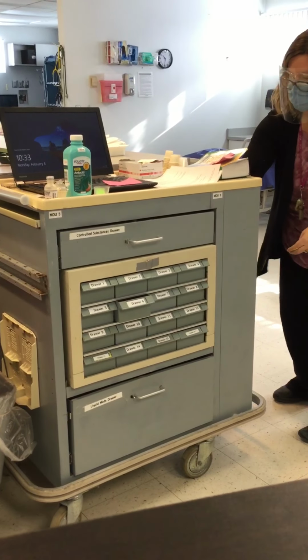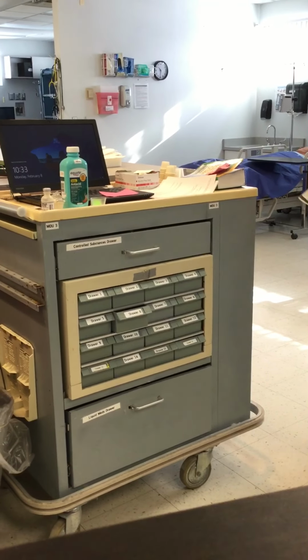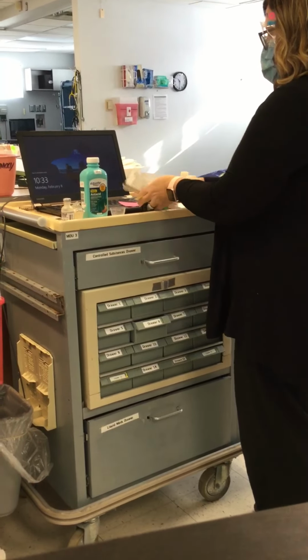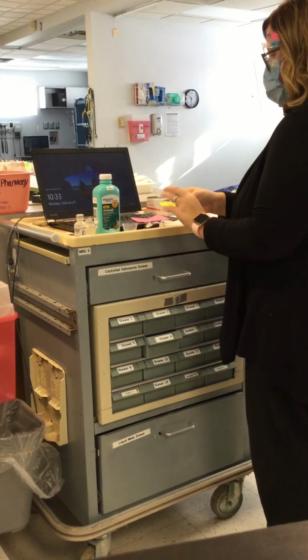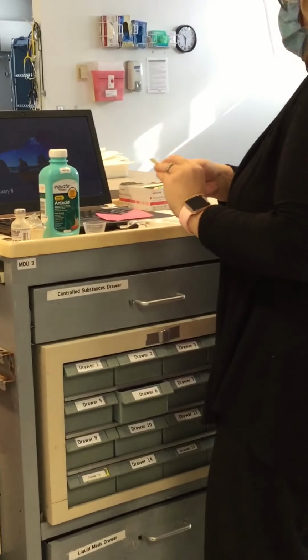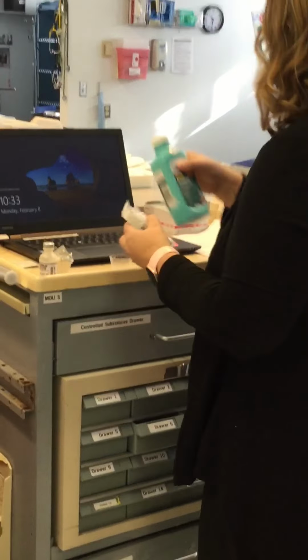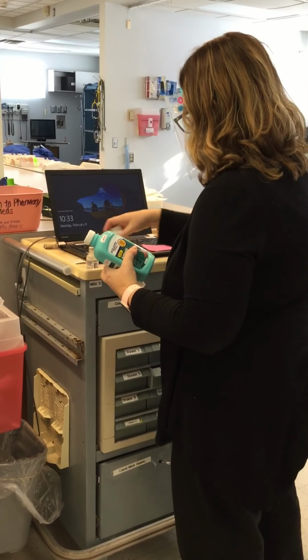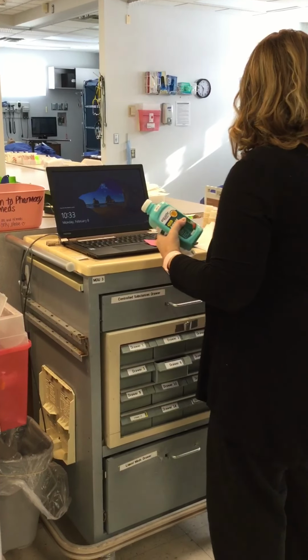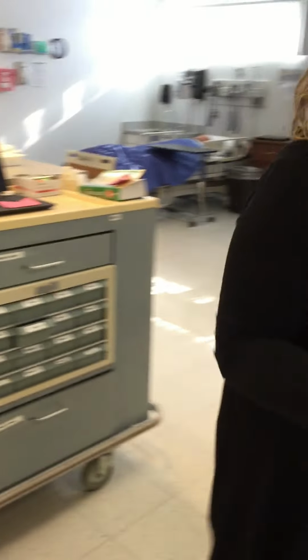There are labels around the room for you to label your syringes. So what you can't see is a dispenser for the various types of stickers to label your medications. So I have the one that says syringe medication. Now I'm going to take everything that I have and I'm going to travel to the patient room. Okay.